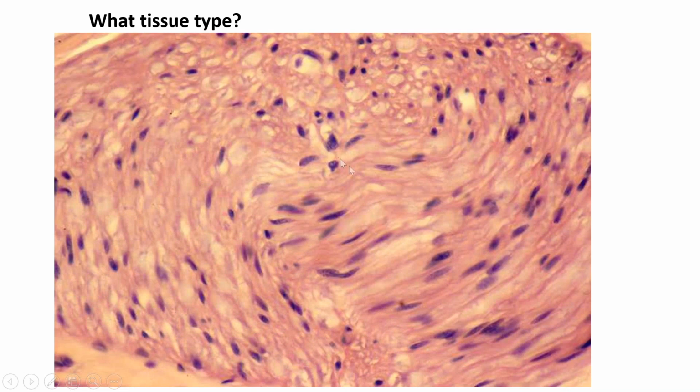What's this? Well, I see all things going in all different directions. So is this smooth muscle? No, it's vacuolated. So this actually is a nerve that's cut in a funny plane. That's an axon. That's the myelin that's been removed. So again, you see roundish profiles, but it is the void of the material in there. It's the lipid that was removed. So that's how I know that that is nerve.